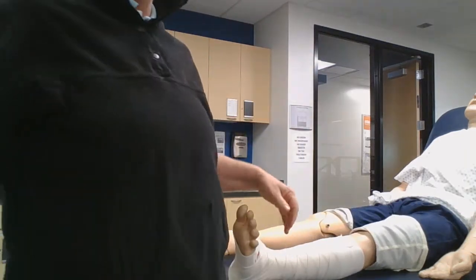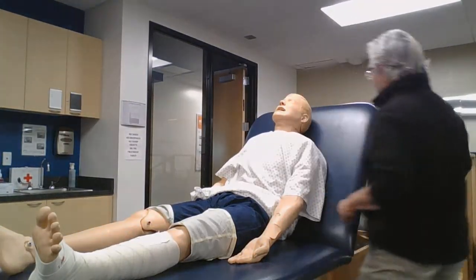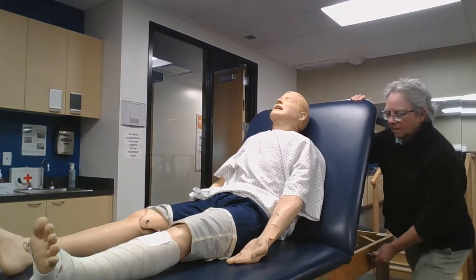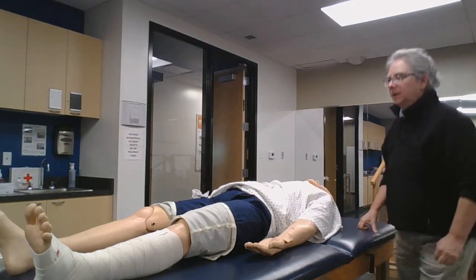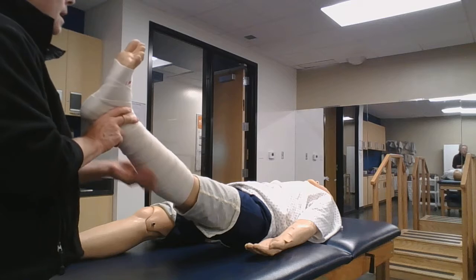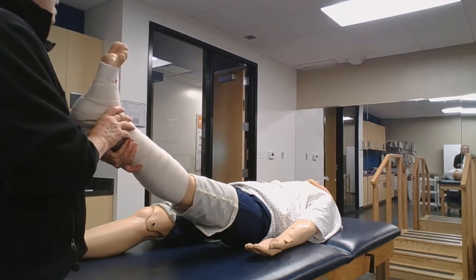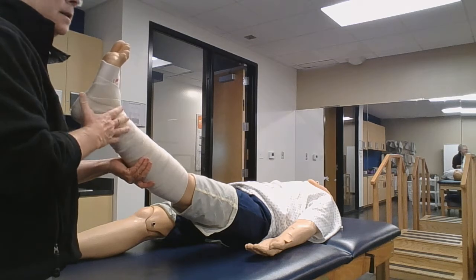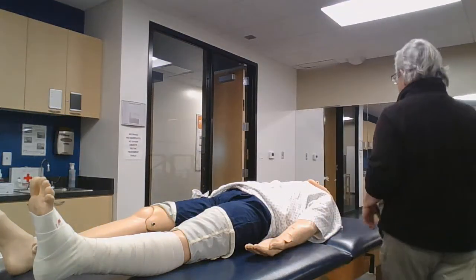So the best thing to do there, let's show Joe, is for Joe to elevate his lower extremity on some pillows. Okay, making sure that he's got some pillows under his knee as well for comfort, and so that this, again, is above his heart. Okay, all right, Joe? And so what else are we going to check for, Joe?